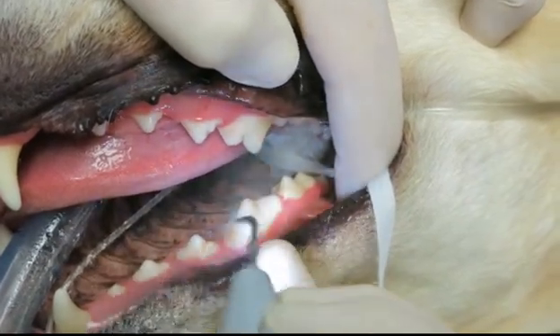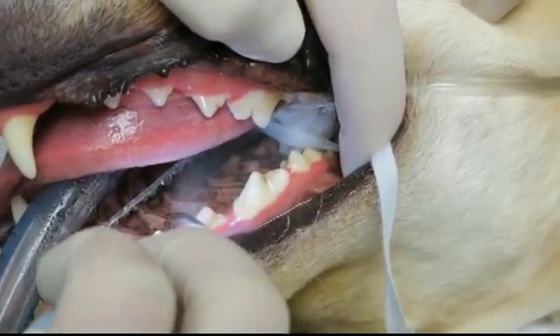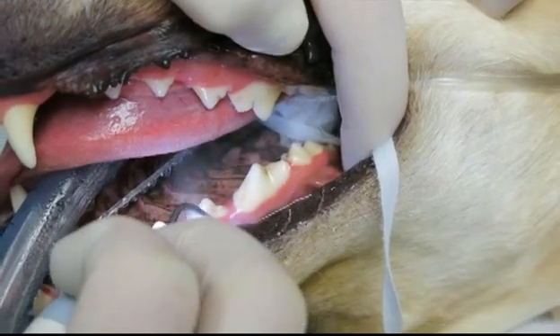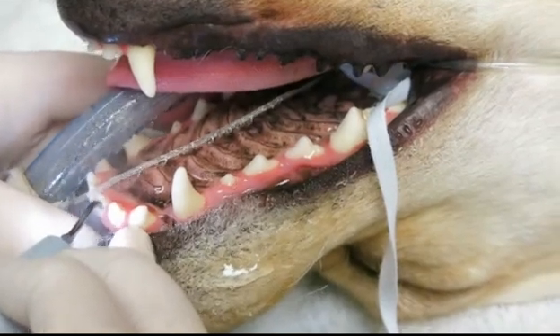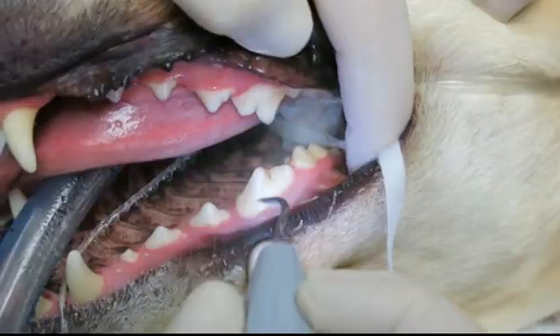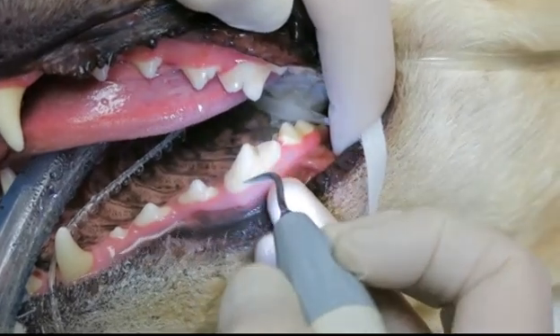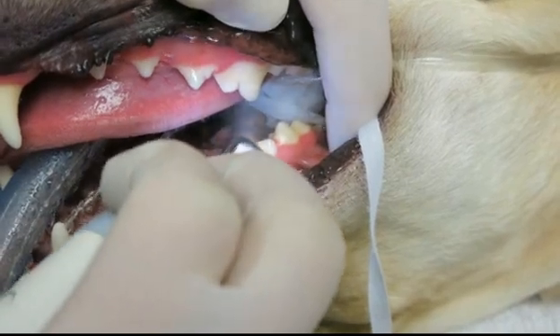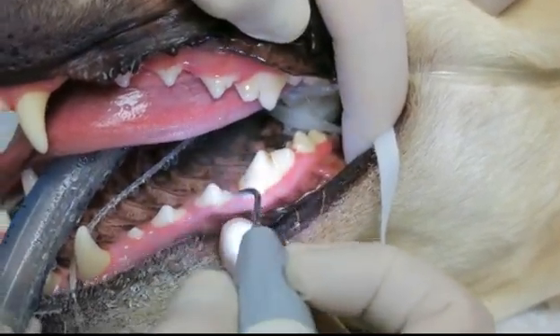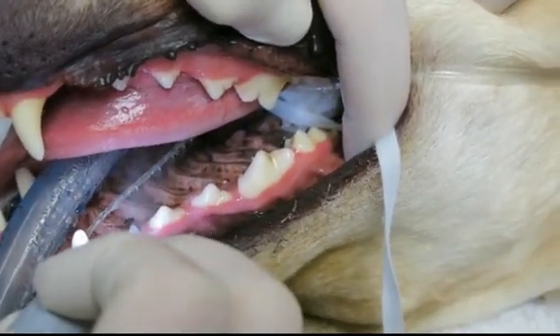Removing all of the calculus. These are quite clean because the owner is doing such a wonderful job. There's not a lot of tartar — most dogs that I'm doing have way more. This is an ultrasonic scaler, removing all of the tartar from the tooth. I'm doing it above the gum line — just doing the crown right now. I'll come back later and do underneath the gum line.